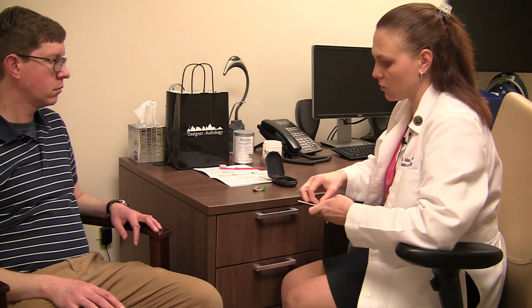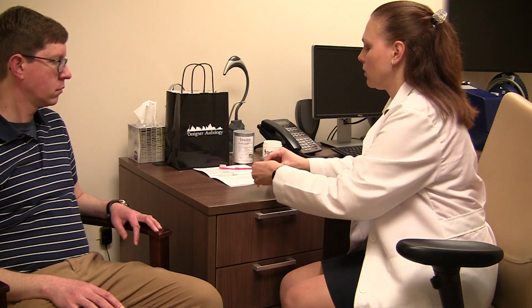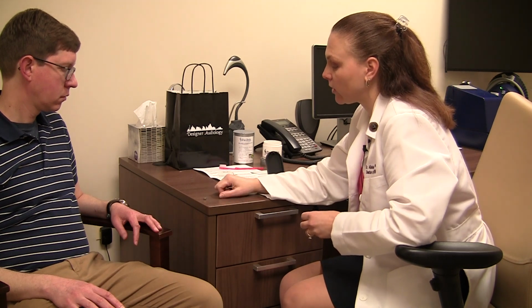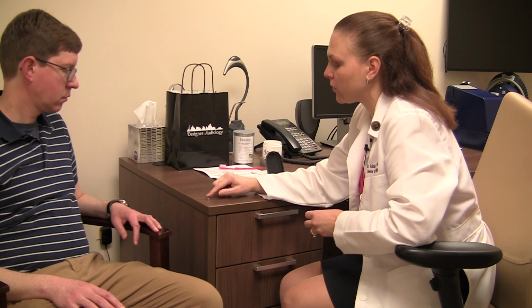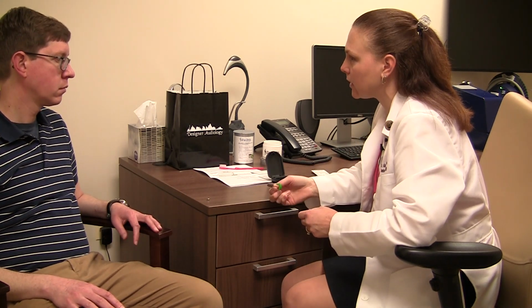When you take the sticker off, the battery is going to look like this. You're going to have that flat, shiny side where the sticker was on top. And then if you flip it over, it's got that negative side that has a ring on it. And we're going to practice putting it into your hearing aid in just a second.